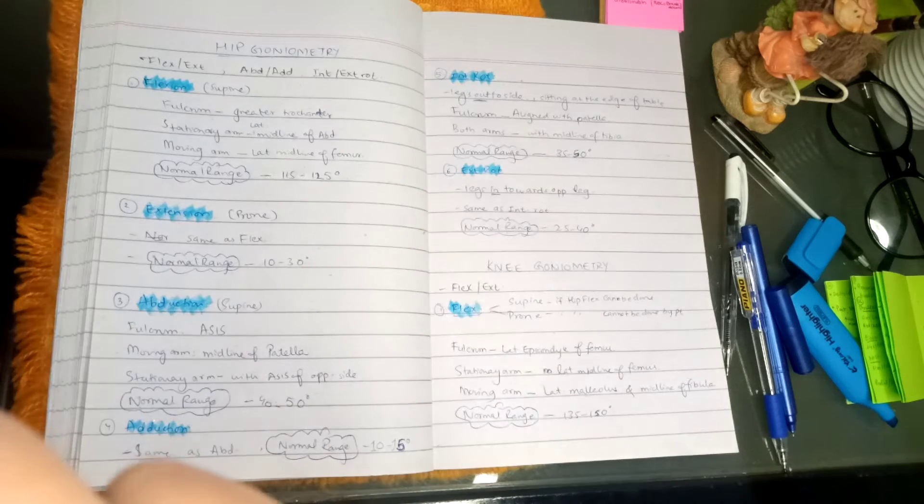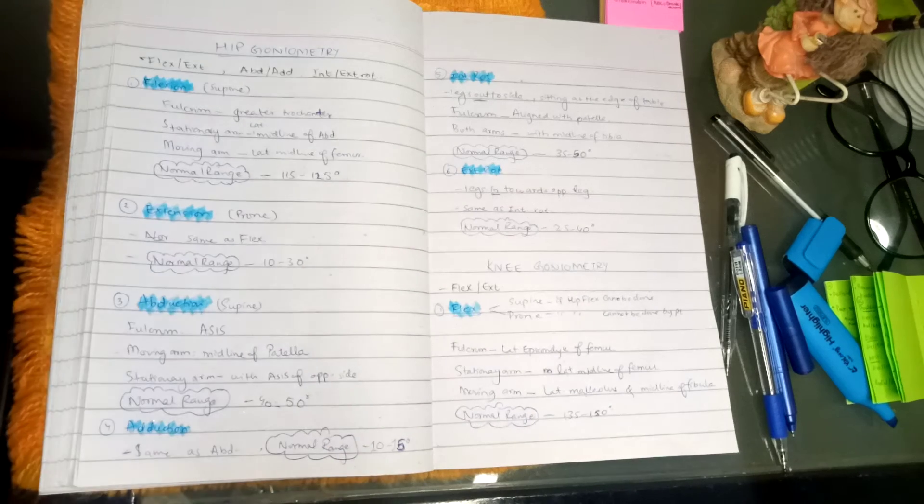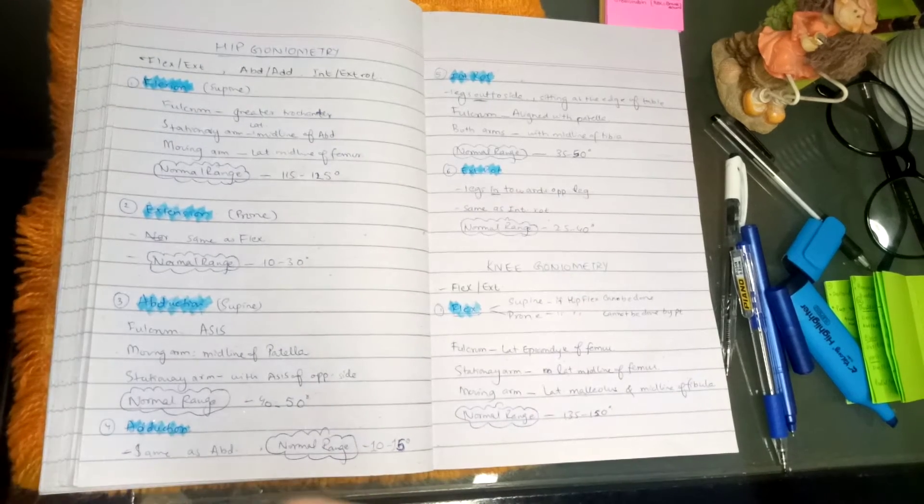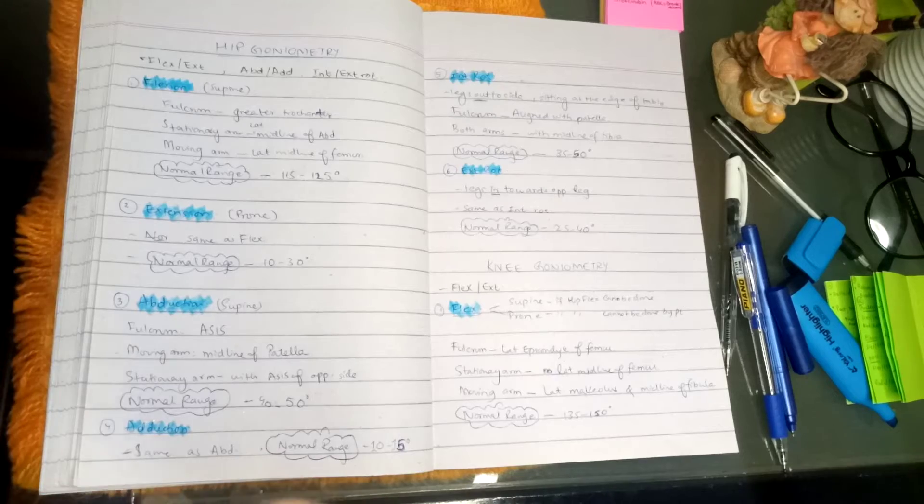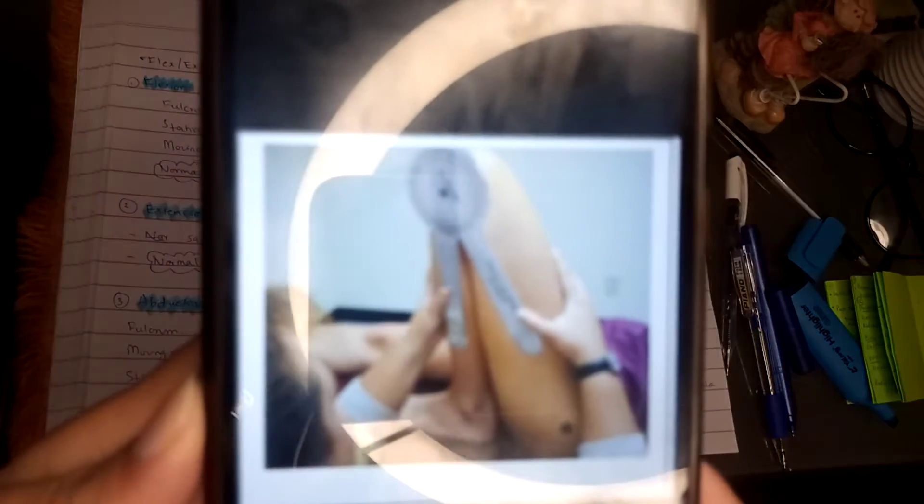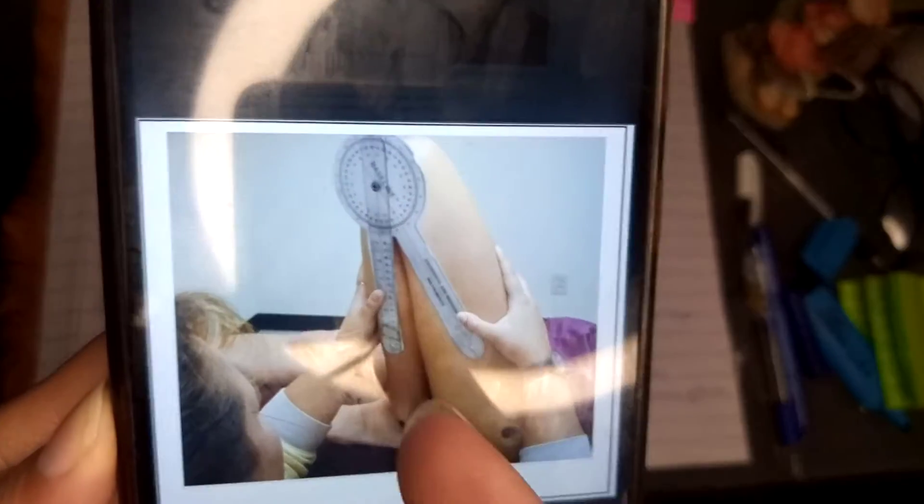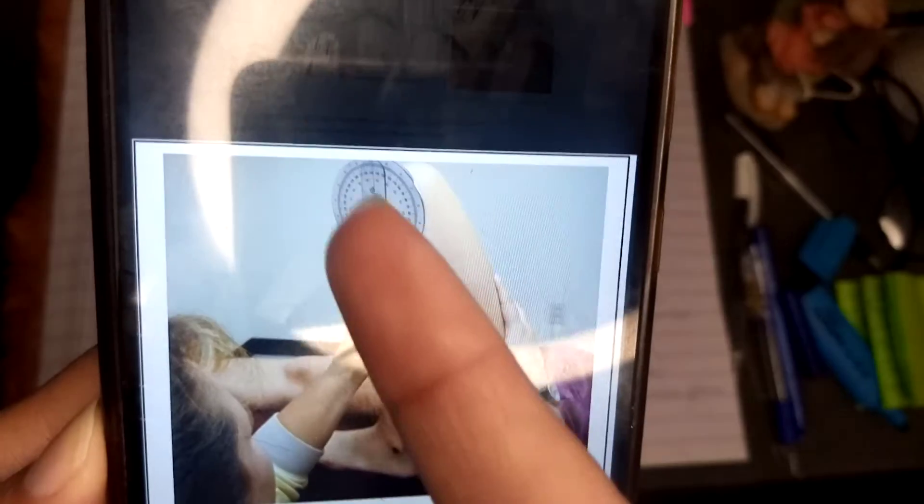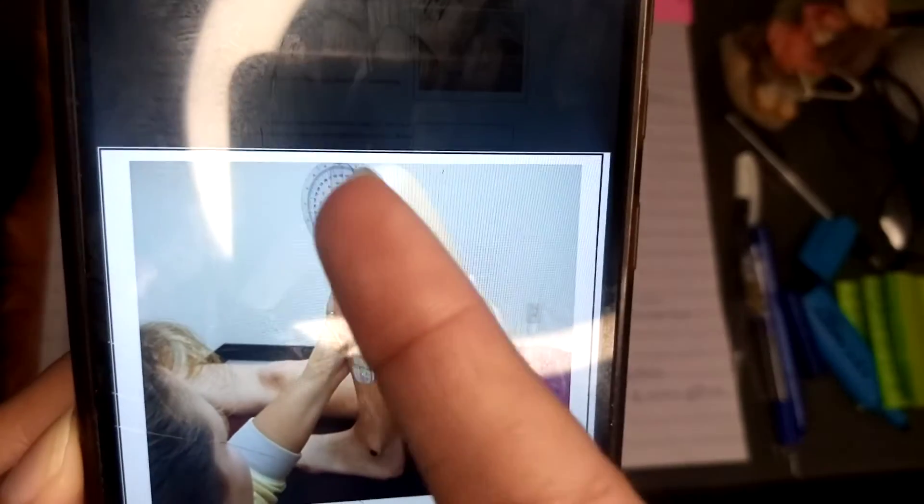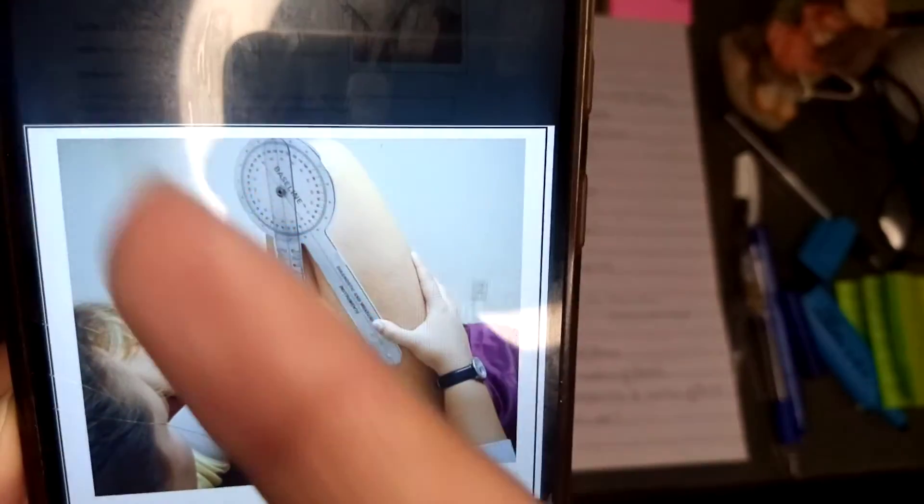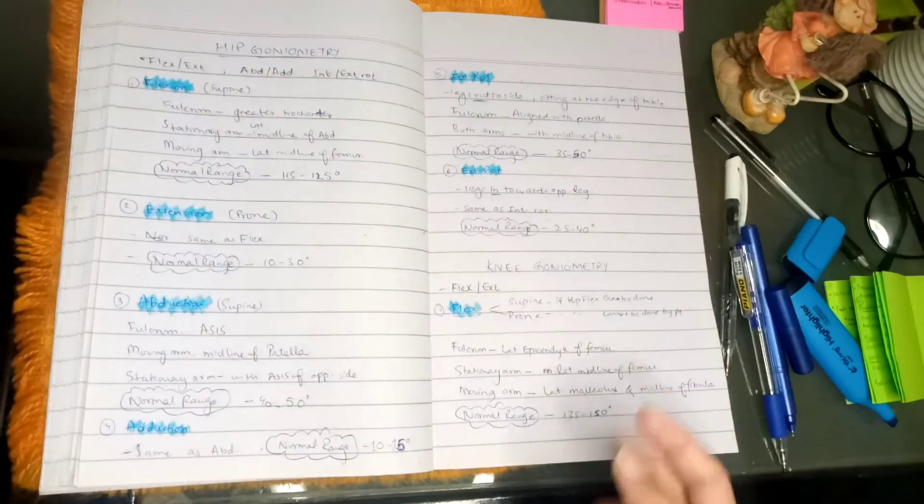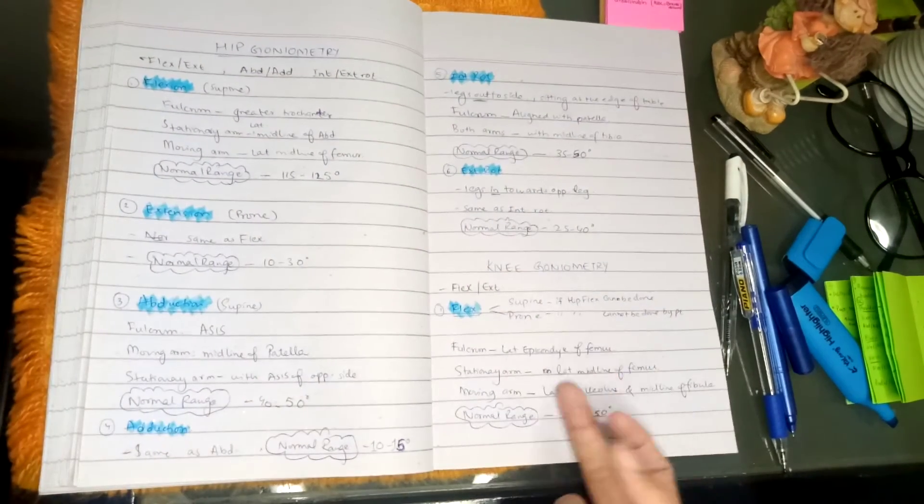I will show you the picture of knee flexion. Wait a sec. So here, what will happen is knee flexion, and the moveable arm aligned with the leg. Now it has moved here. So we will see the normal range.